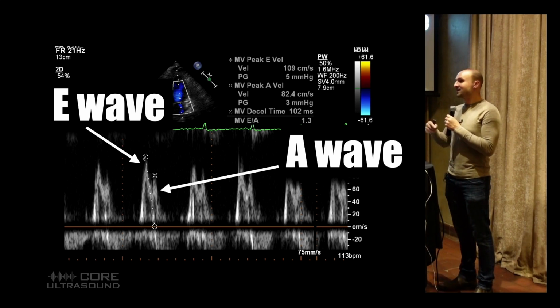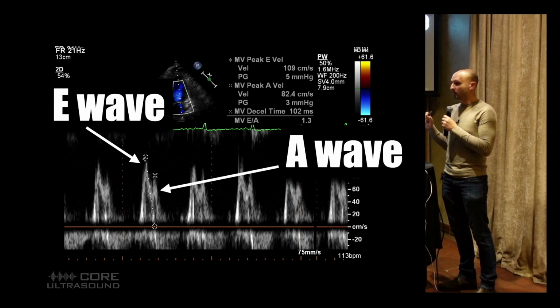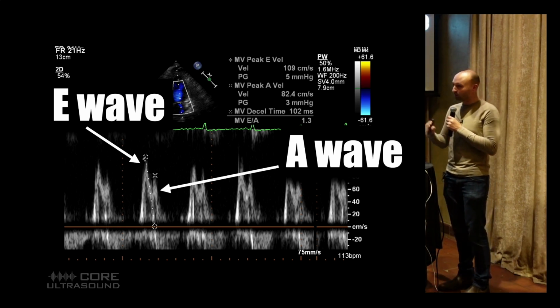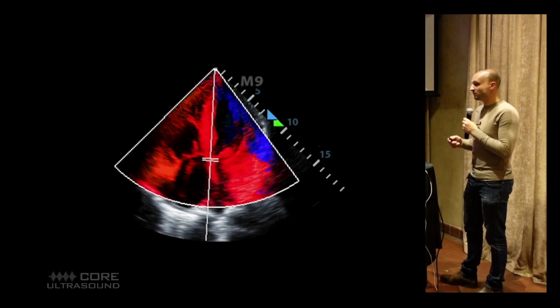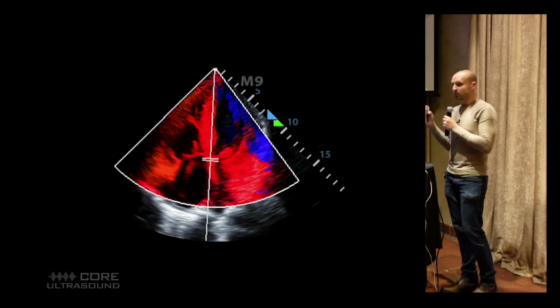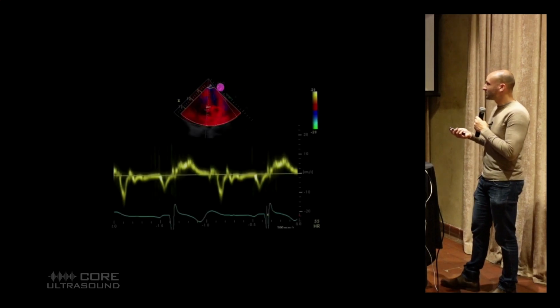The second half is another pulse wave Doppler. What you want to do is change the setting of your ultrasound machine to do tissue Doppler imaging, TDI, because it changes the scale. These are pretty high velocities, and if you're measuring the movement of the tissue, those are really low velocities. So it automatically changes the scale so you can measure the tissue velocity next. You can place this either on the lateral annulus or on the medial annulus. There's discussion as to which one is best. For me, it's whichever one I get the crispest view of. I usually end up using the medial one.